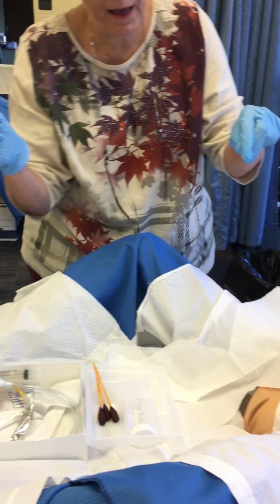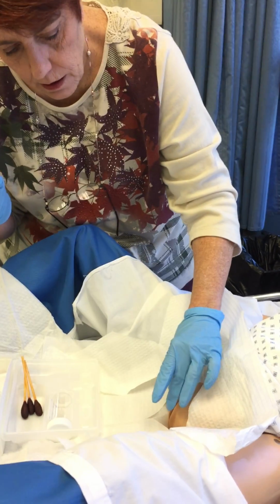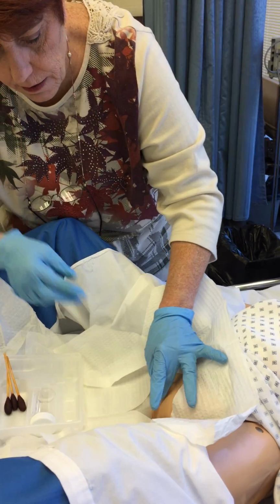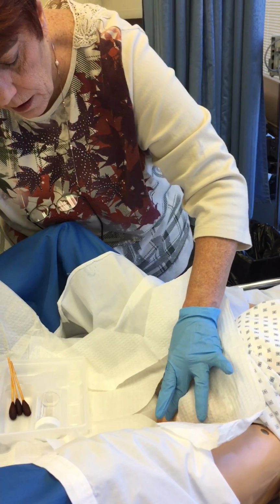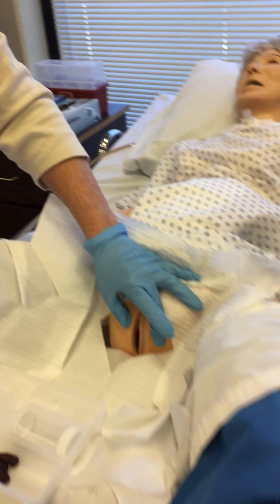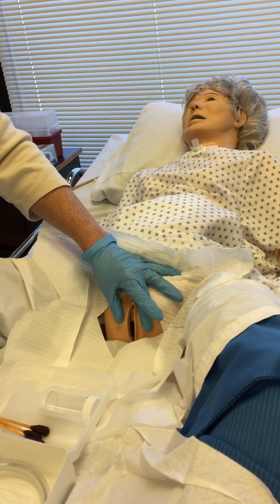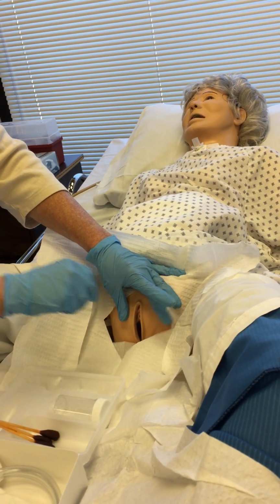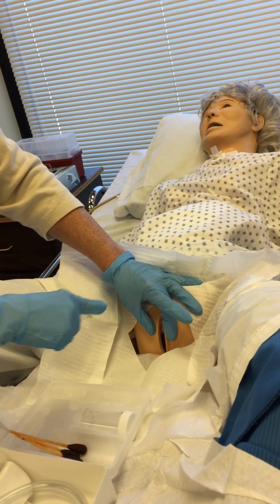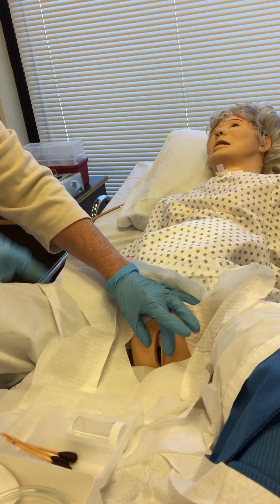All right. Now we're going to spread the labia. We're going to use our non-dominant hand to spread the labia. And when I say spread the labia, I mean you've got to spread the labia. Whoops, can't use that hand. It's hard to tell on these mannequins because they're not exactly like the human body. But a lot of students, when they practice, just barely spread the labia, and when they go to clean, they're cleaning the outside of it. You got to spread the labia because your goal is that hole in the middle. Okay? So this hand is now dirty.